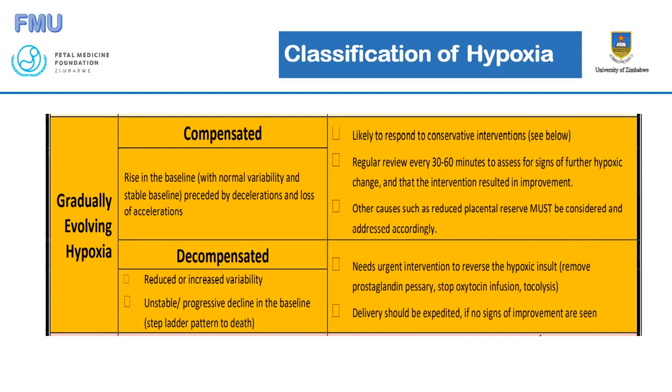is that we don't have 20 CTGs. Our 2 hospitals are high volume centers. As a result, we have to carefully select our patients so that, one, we can cope, two, we can offer the CTG to the women we think will really benefit, and also so that the staff can cope. So I do not see us being able to do an admission CTG for now, but we have to further stratify our high-risk group into a very narrow group so that it is workable for the moment, because we have 3 CTGs for each of the hospitals, and 1 would definitely be required in labor ward, and probably another one in early labor ward, and maybe another one in antenatal ward. Already they are not enough. So things like that will make it impossible to do that.